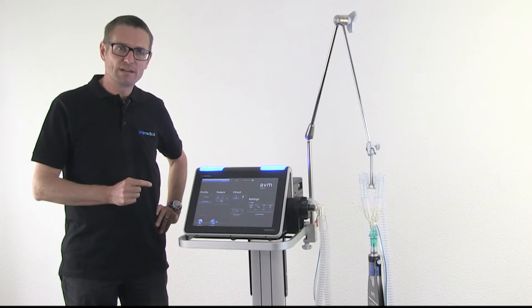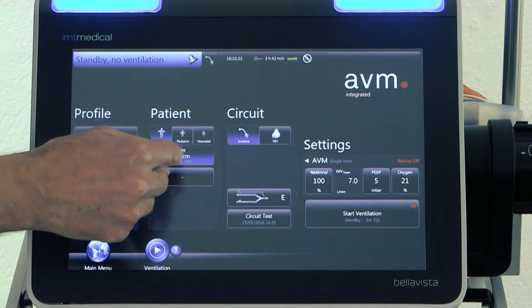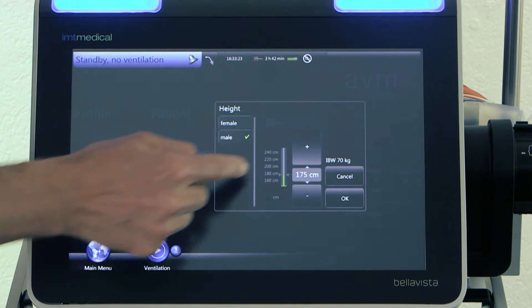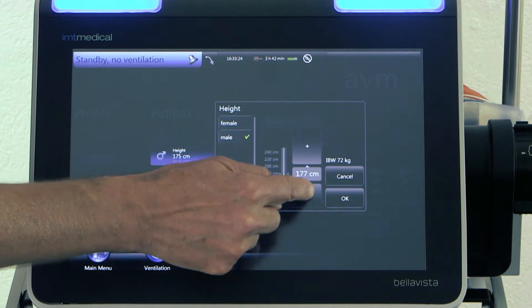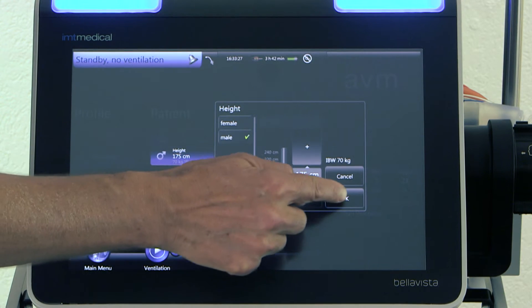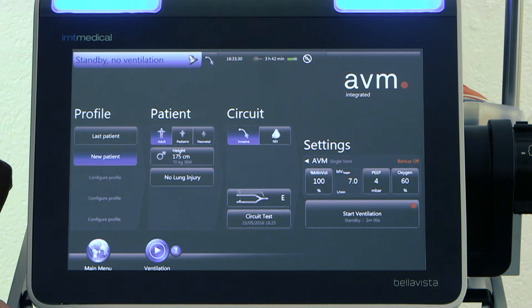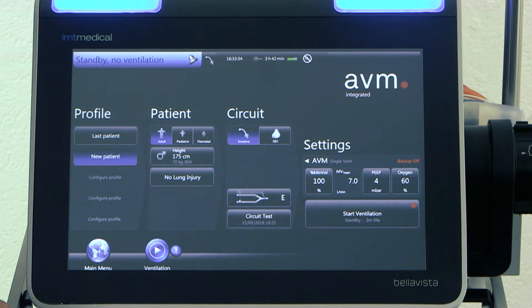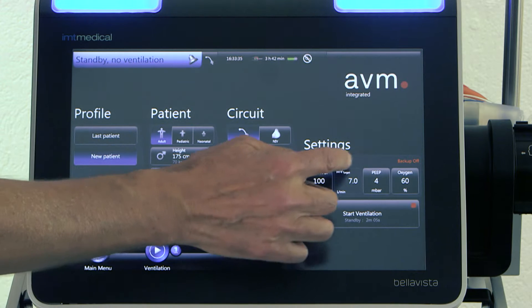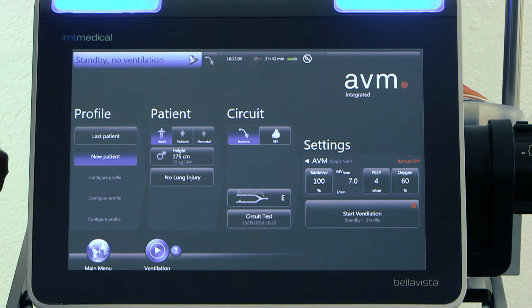In Bella Vista AVM mode, this is different. You choose the patient's height — for instance 175, male — select OK, and this defines the patient's requirement for ventilation in liters per minute. In this case, 7 liters per minute.